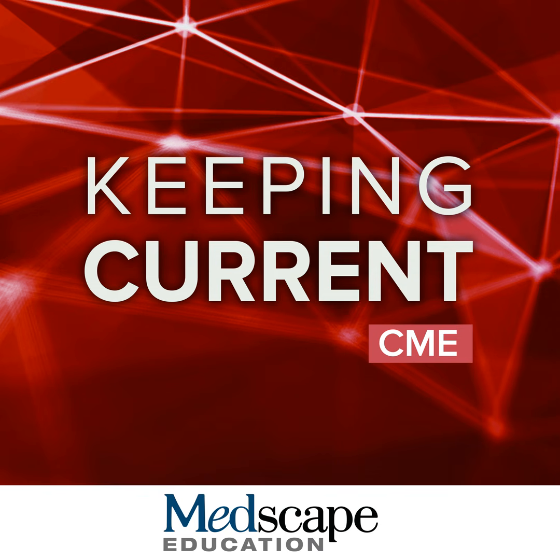So you can see his Centiloid was very low. Now, if we go and reposition him and do the correct modification, his Centiloid actually now goes to a positive 66.5 when we're using a cerebellar reference region and are looking at the right regions of the brain. So if you looked at this scan, you could easily get the wrong result. But if you actually dig into the QC, paying attention to the Centiloid is very, very important.